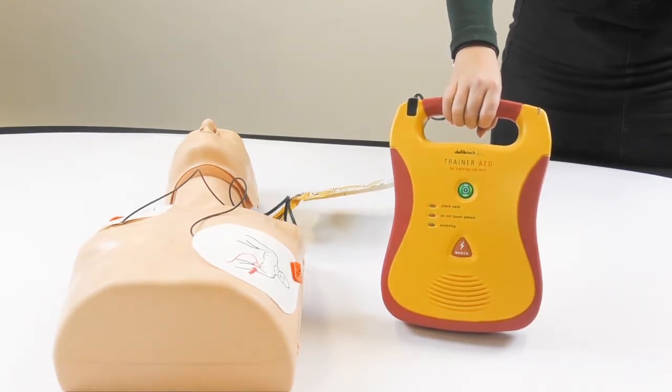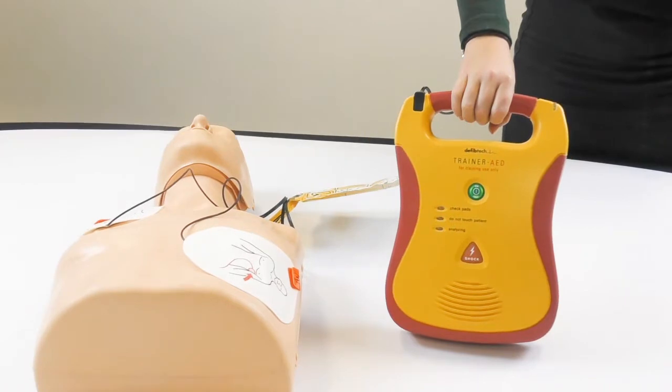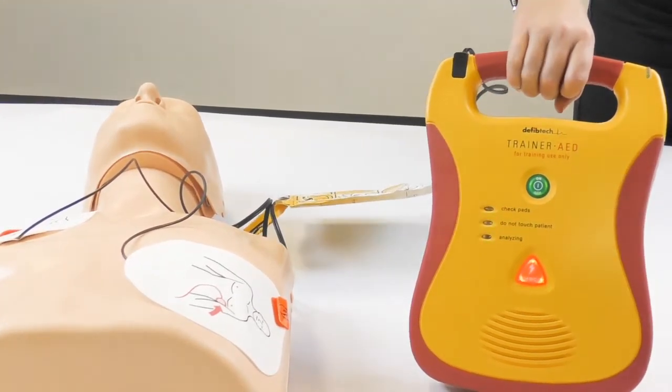Shock advised. Charging. Stand clear. Press flashing shock button.